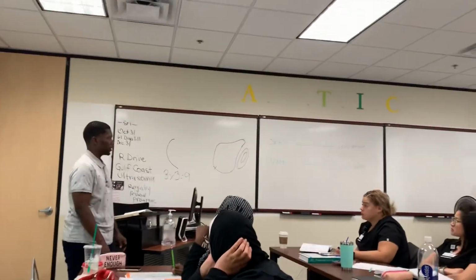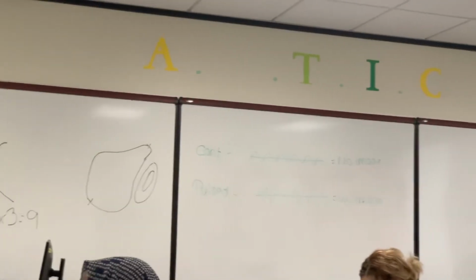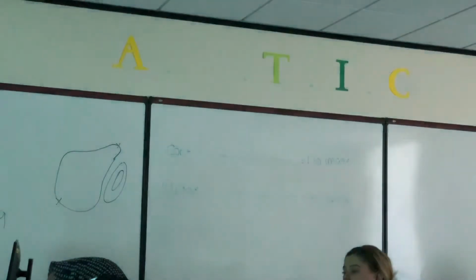Then it's going to listen. Another 2 cycles are traveling, then it's going to listen. Another 2 cycles travel, then it's going to listen. I just drew 2 because I wanted to draw more than 1, to represent a pulse. I could have drawn 4 like the previous picture. Okay? Pulse ultrasound has 2 components.